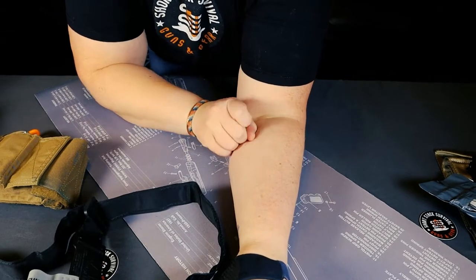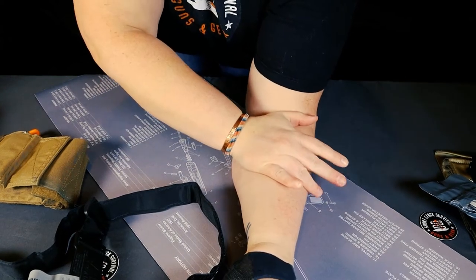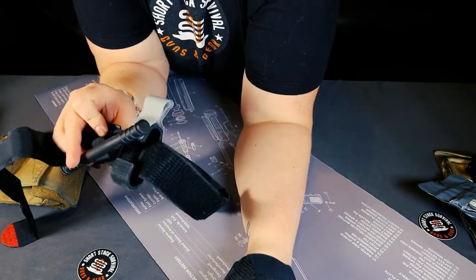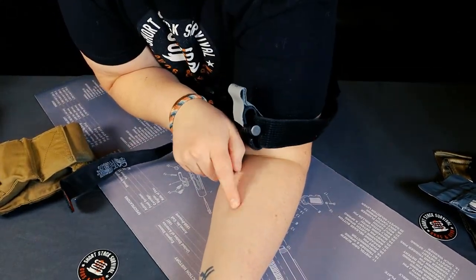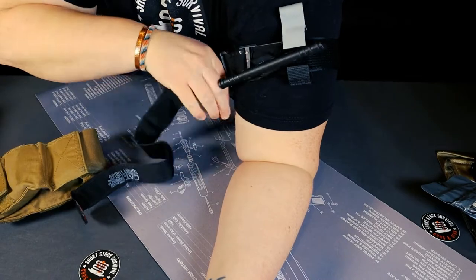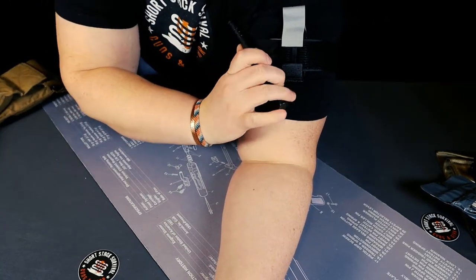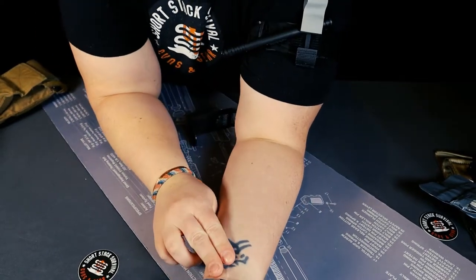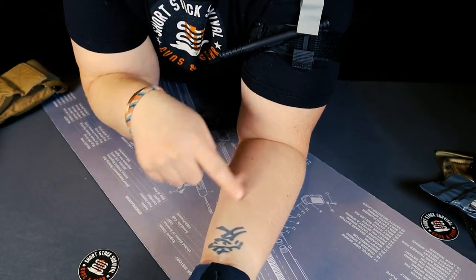If you had an injury that was squirting bright red blood — a massive amount of blood — and direct pressure isn't cutting it and it's still bleeding, that's absolutely when you'd want to use a tourniquet. If I was applying this tourniquet to myself, I'd go high, even though the injury might be lower on the arm. Pull it tight, just keep cranking down. You want to get it uncomfortably tight. Then you grab the windlass and start cranking — at least one full turn — and then you can check for a pulse. I have no pulse, so I have properly stopped the bleeding down to my arm.